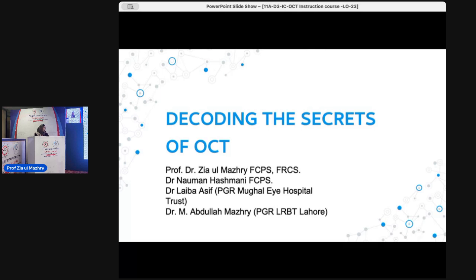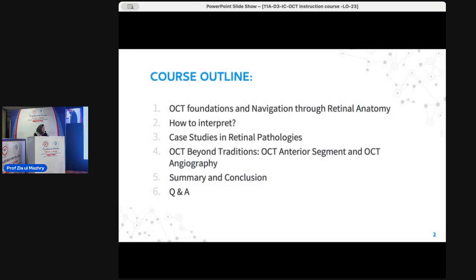Bismillahirrahmanirrahim. So I'll start this session by giving an overview. What are we going through today in this session of OCT? We'll go through the OCT foundations and navigation through the retinal anatomy. We'll go through how we interpret OCT reports with the help of different case series and different cases that we're going to study.